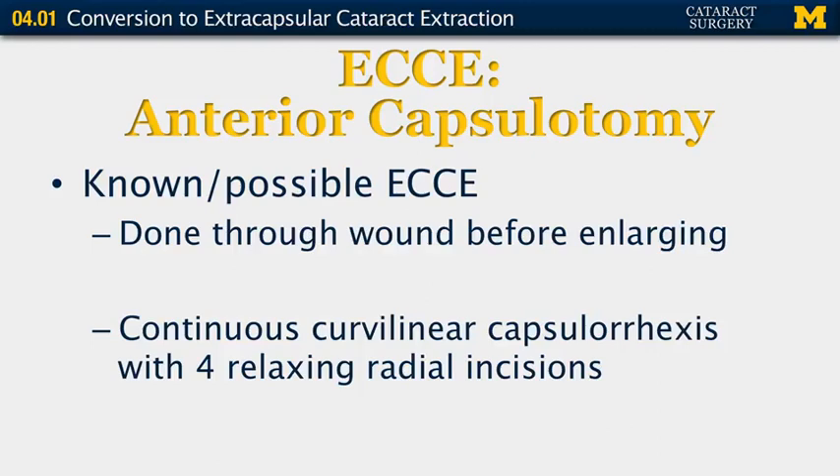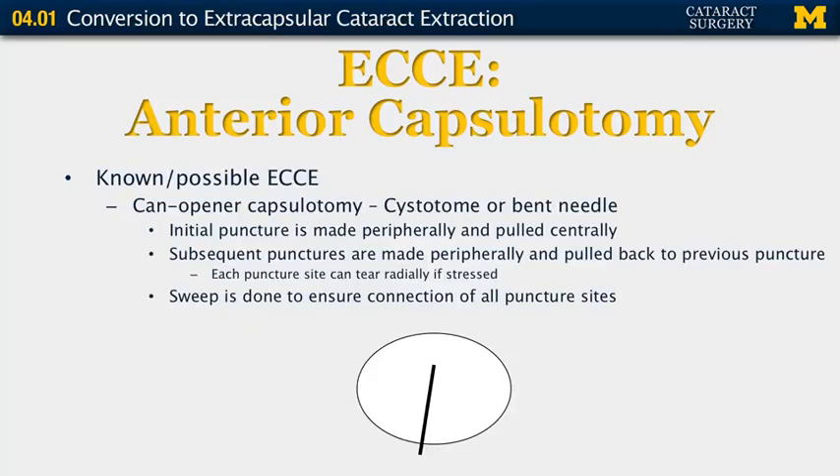The continuous curvilinear capsulorrhexis can be made as you normally would with phacoemulsification, and then four relaxing radial incisions can be made from the capsulorrhexis. Alternatively, if you know or think you'll be performing an extracapsular cataract extraction, you can opt for a can-opener capsulotomy. For this, you use a cystotome or bent needle to make an initial puncture inferiorly, pull it centrally, then make subsequent punctures peripherally and pull back to the previous puncture — like a connect-the-dots puzzle. Each puncture site can tear radially if stressed, so you must be careful. When done, sweep with your cystotome all the way around to ensure the capsule is completely open with no adhesions.